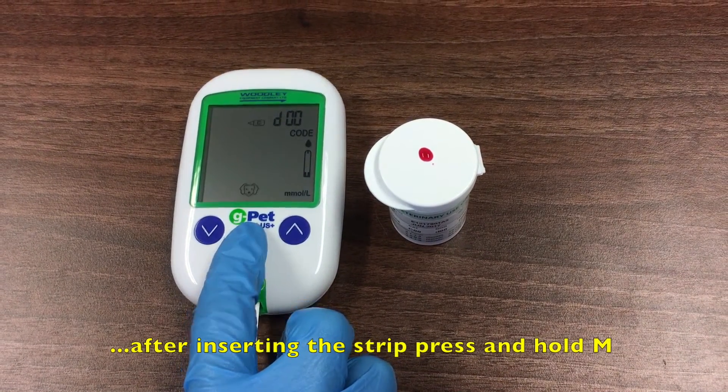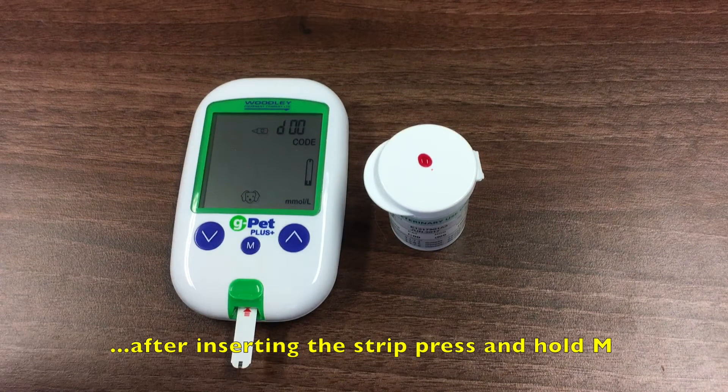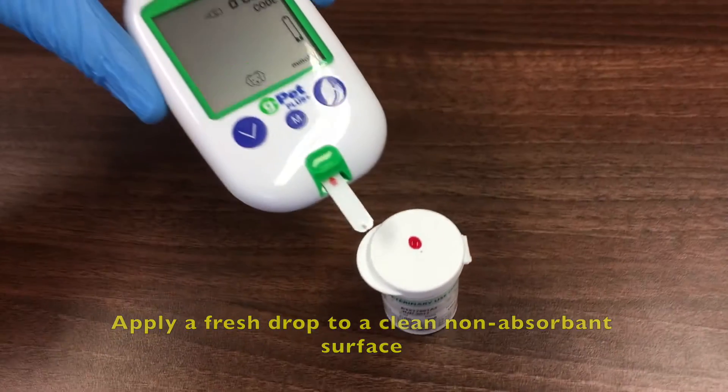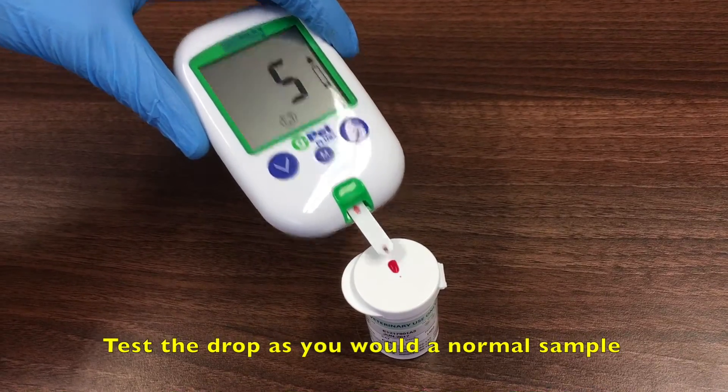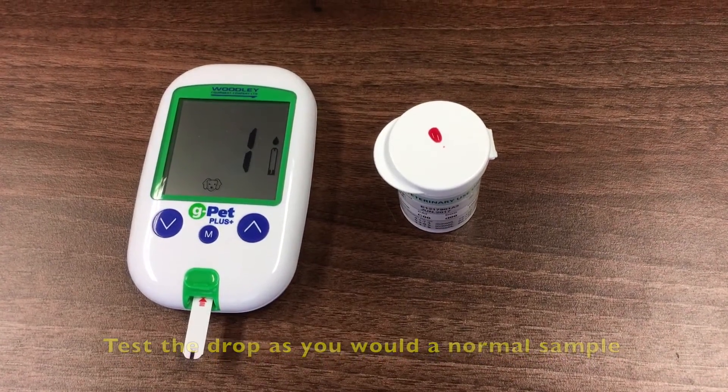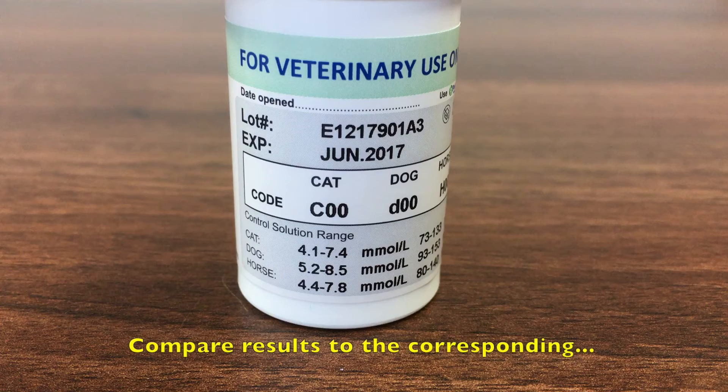Alternatively, after inserting a strip, press and hold the M button for 2 seconds to change to quality control mode. When testing QC, thoroughly mix the bottle, discard the first drop and apply a fresh drop to a clean non-absorbent surface. Test the drop as you would a normal sample and compare the results to the reference range on the strip vial.